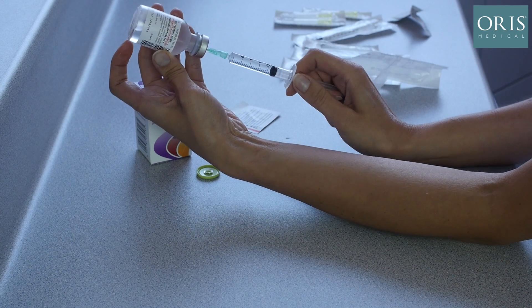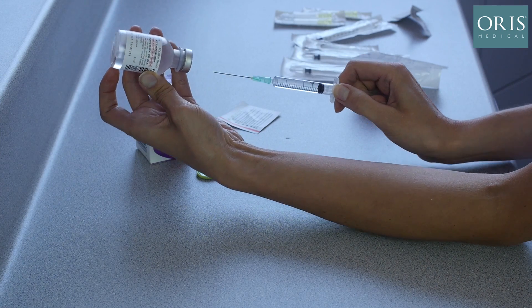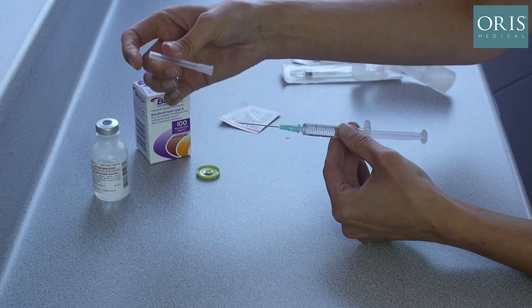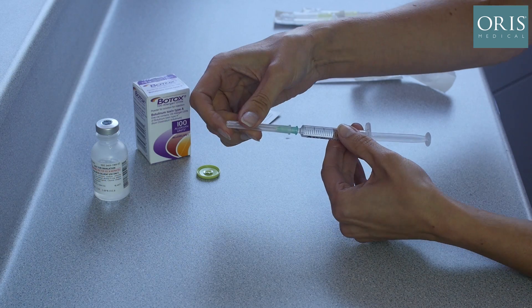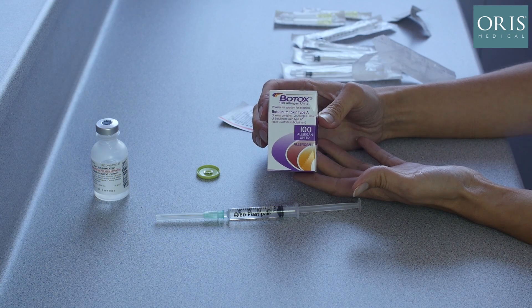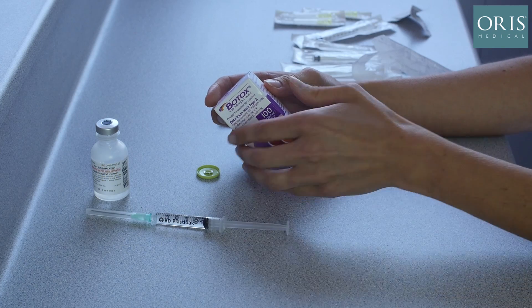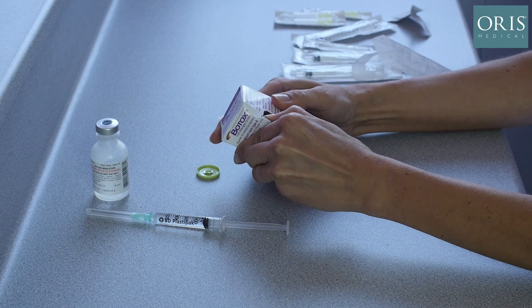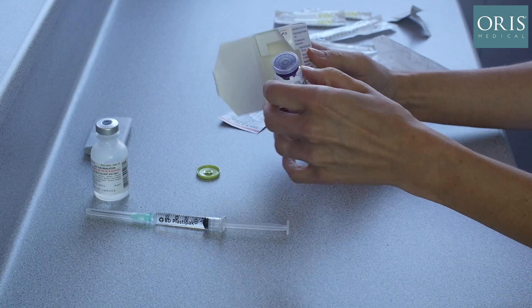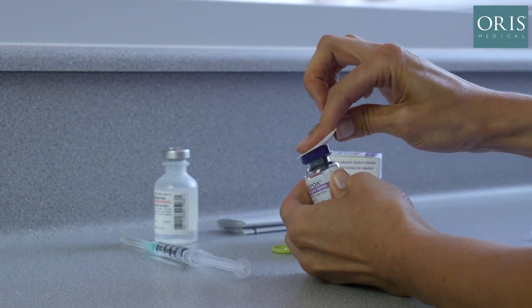Any air in the syringe is expressed. This is our box of 100 units of Botox. Looking underneath, we can see the expiry date and the lot number. Ensure it is in date before we open. The cap is removed and the rubber stopper is cleaned using an alcohol wipe.